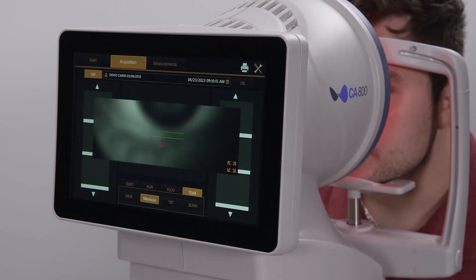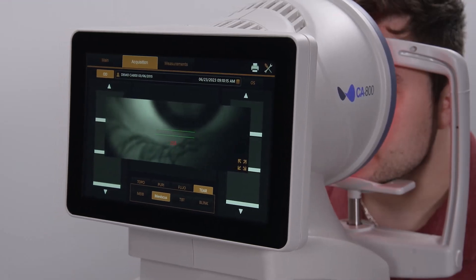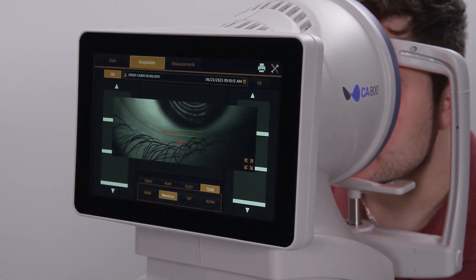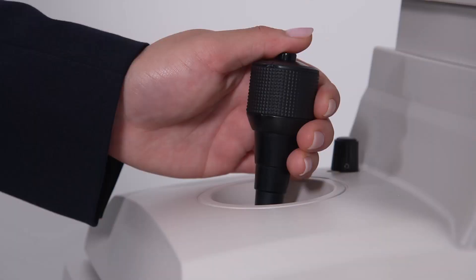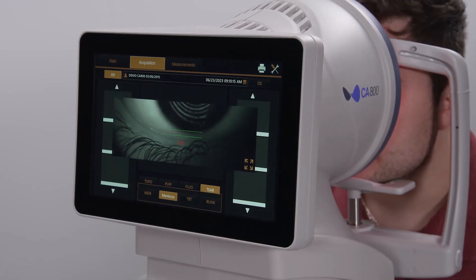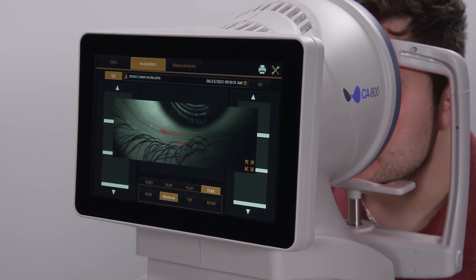Use the joystick to center the red reflection of the tear meniscus between the green lines and move slightly in and out to maximize the red signal from the tear meniscus. At this point, press the joystick button to capture the image. You may want to capture two or three images for your records.